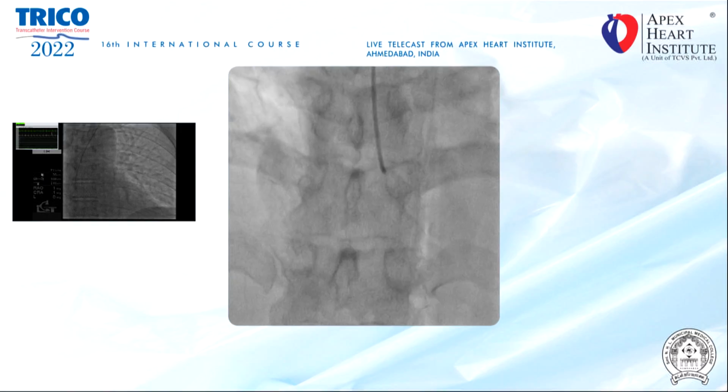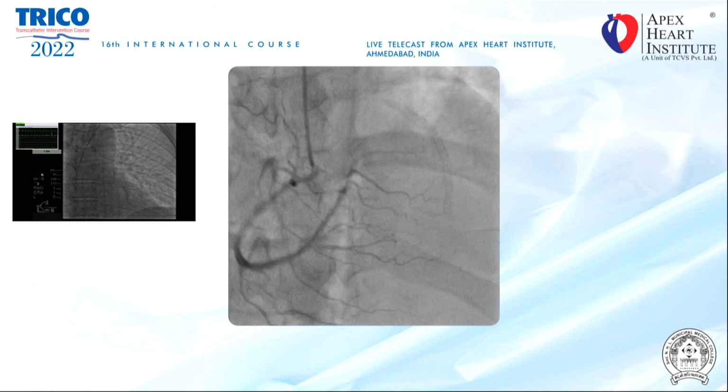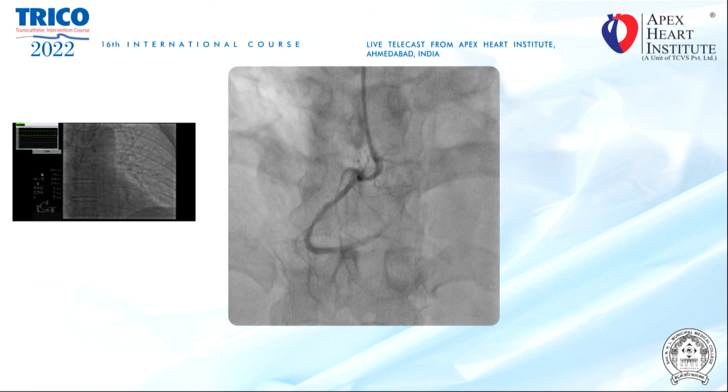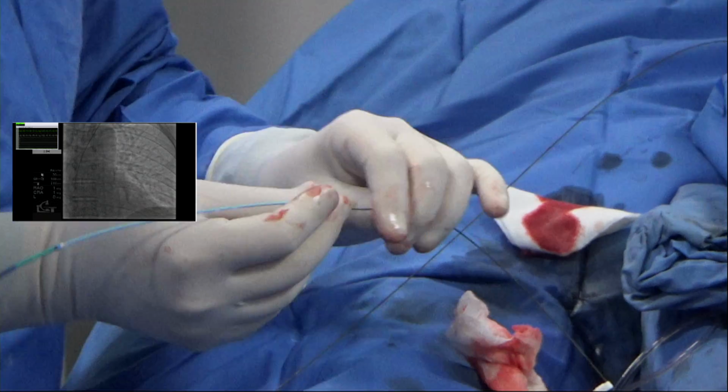You'll take AR1 now. We'll use the same wire, so save the wire we just used, and I think the tip should be okay. Go ahead and flush. So we're using again the combo technique as taught by Professor Patel.